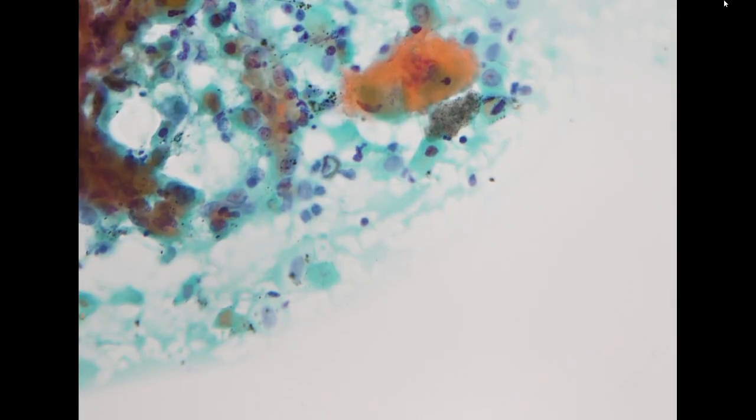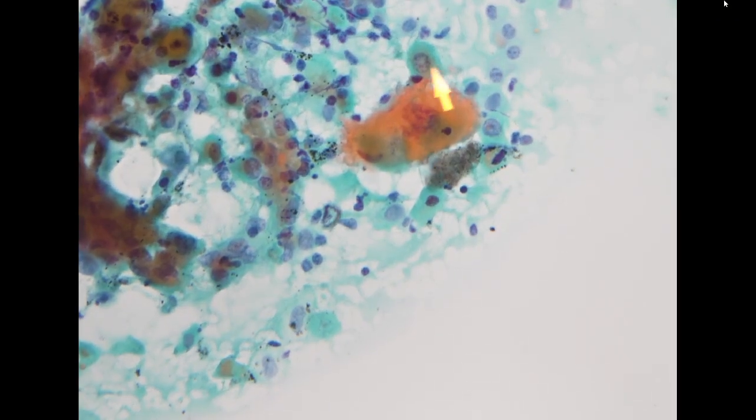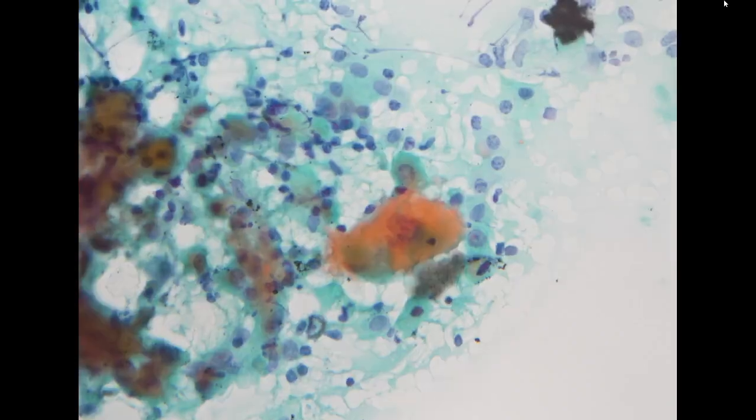In this specimen, there are definitely some cells with squamous differentiation, because you see these eosinophilic, very dense cytoplasm. So you see atypical cells, some with prominent squamous differentiation.